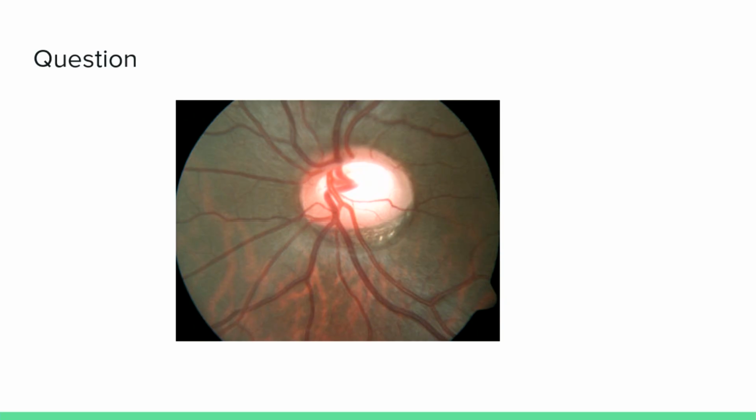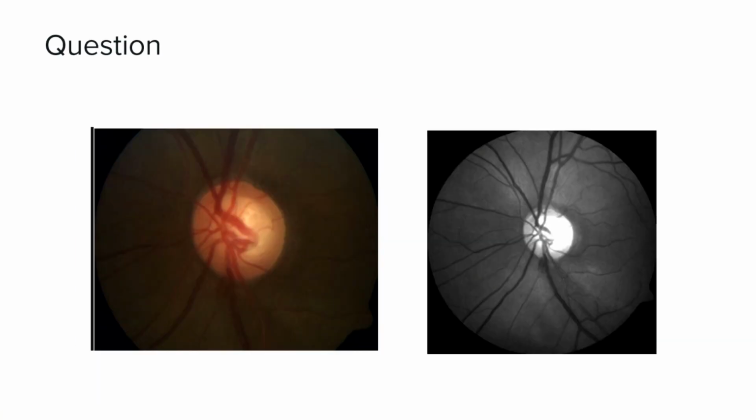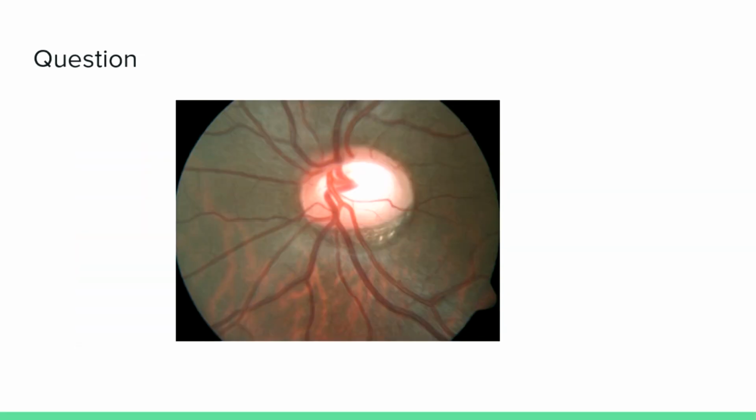How do we tell if a rim is sloping? You described it, no? It will be a partial loss of the rim in the area. Follow the slope of the vessel. If it's not bending, it's going like this, you see in the previous one, no? The myopic one. So if you see the vessel inferiorly, it's just going, it's not bending, the smaller one. It's just going straight down, right? The bigger vessel is not bending anywhere. So that will be a slope.